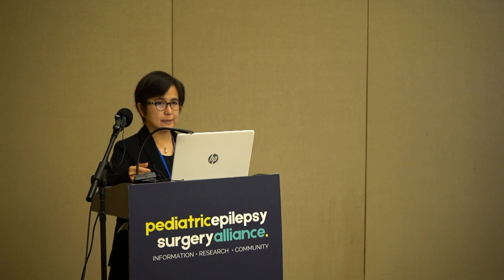The other factor that affects our ability to identify a lesion is the expertise and experience of the radiologist. Typically, specialist neuroradiologists will detect more lesions compared to non-specialist general radiologists, and specialist neuroradiologists with experience and expertise specifically in epilepsy imaging will also identify more lesions compared to neuroradiologists who subspecialize in areas other than epilepsy.